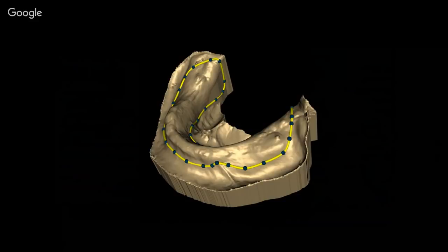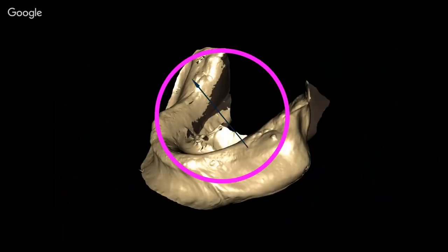So what I'm doing right here is I've just told the software I'm going to make a denture, and I'm going through and defining a border to this. And really what I'm doing is I'm just going to generate a base that I can use as a master impression tray. So I'm defining this. I'm leaving it short of the borders because I know I'm going to go in and do border molding with it. That slides out of order, but that corresponds to the undercut.